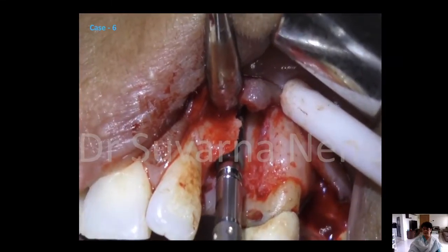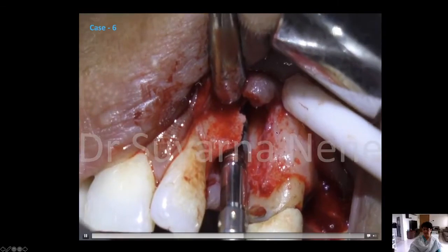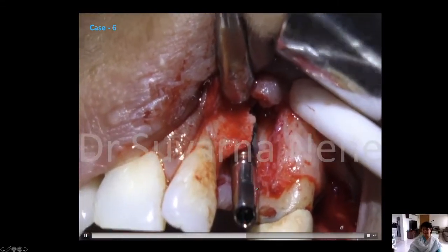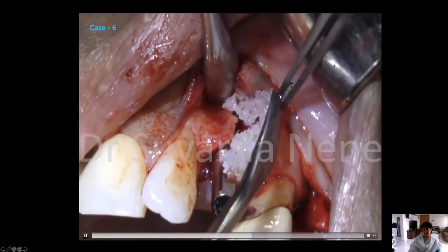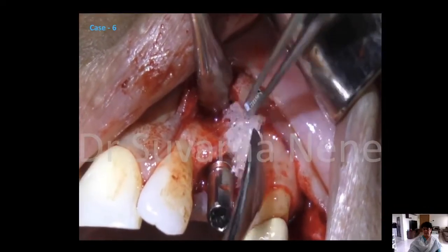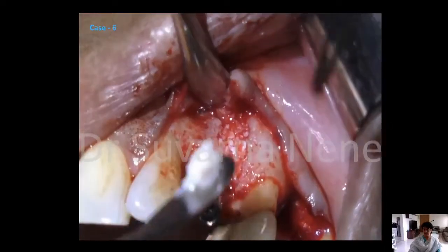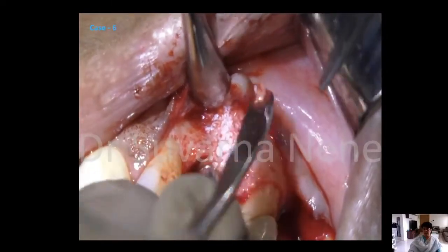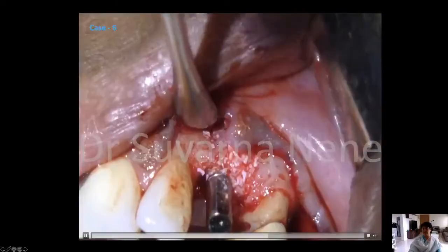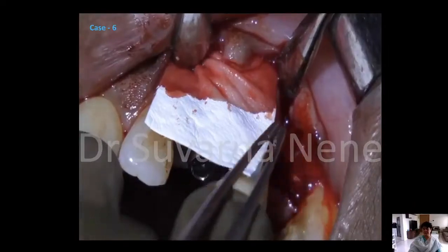You can see the dehiscence, but you also can see that this entire distal and palatal bone plate and whatever the cover of the buccal plate will allow the graft to turn over. Okay, this is a titanium instrument designed by Professor Marco Degidi. It's a good instrument to be used around the implant in the socket. And now we have more xenograft in the mixture in the periphery, and more allograft is placed around the implant, because we want good integration of the implant. Nevertheless, we want buccal bone stability.